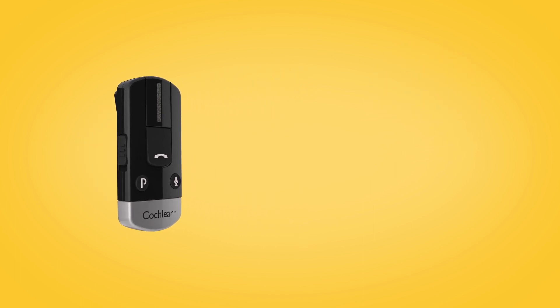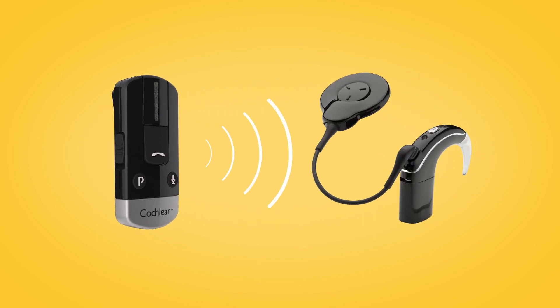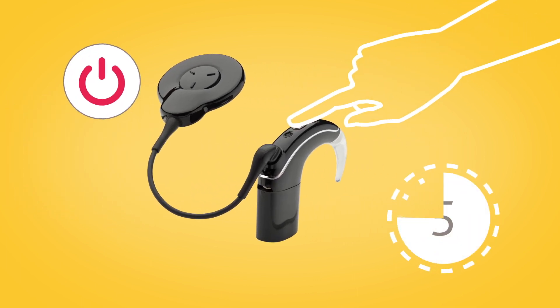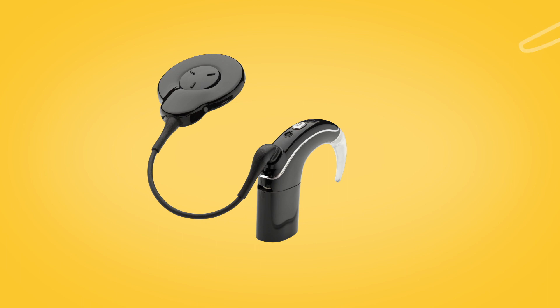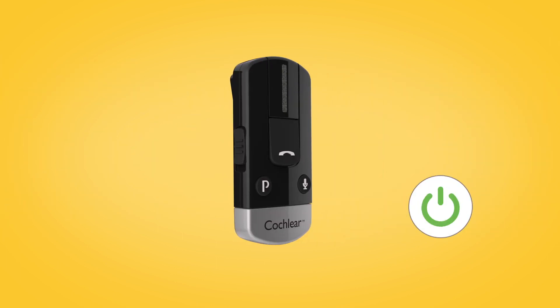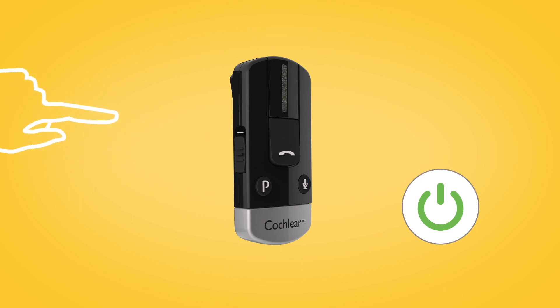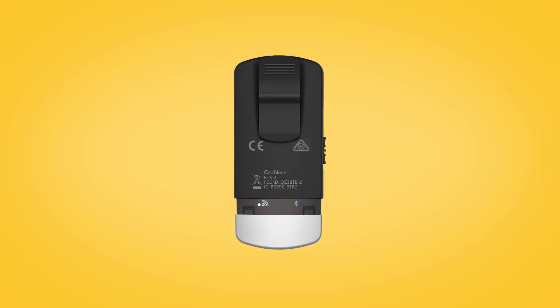To pair your phone clip with your Nucleus 7 sound processor, remove and turn off your sound processor. Then, switch on your phone clip by sliding down the on-off button. Remove the silver cap and use the tip of a pen or similar object to press the white pairing button on the back.